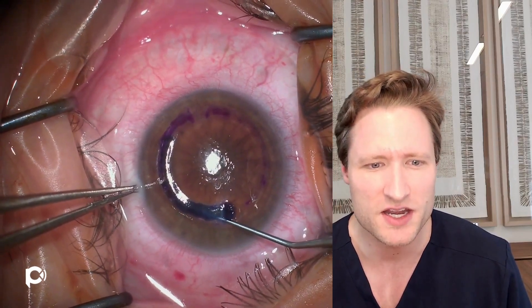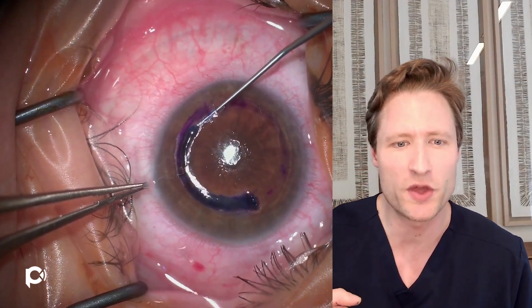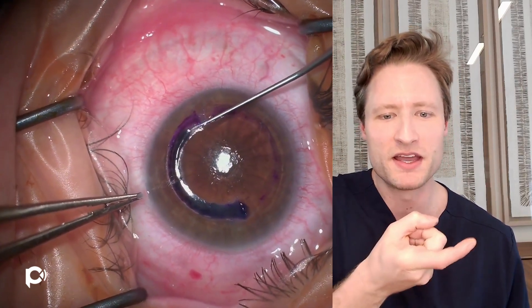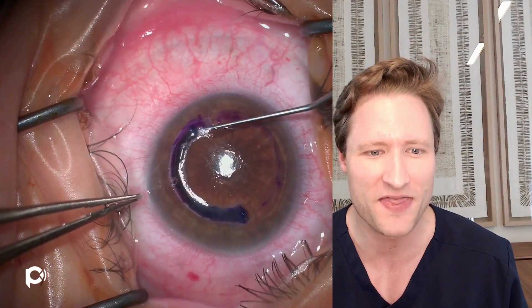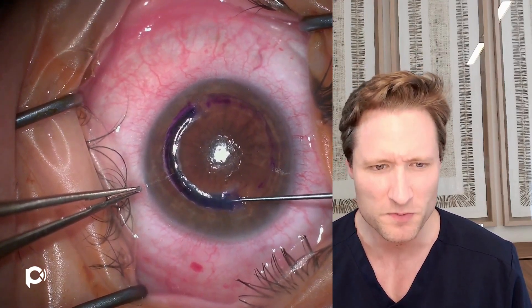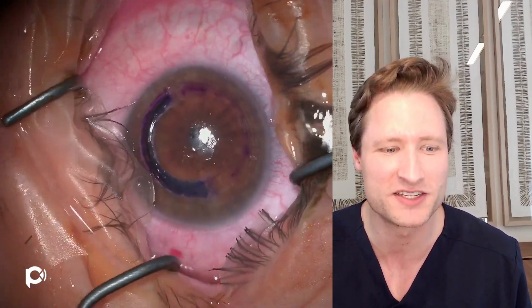I've got the segment nearly all the way placed with just the trailing end hanging out through the temporal wound. I'll use the nasal wound I created to pull the segment over — going underneath the segment with this inverted Hitsinsky hook, pulling up, and then dragging it toward the nasal incision. That ensures the segment is fully filling the manually dissected channel. Then I'll push this little temporal aspect in through the temporal wound, because you really don't want the segment hanging out through either wound — you want it fully positioned inside the cornea.